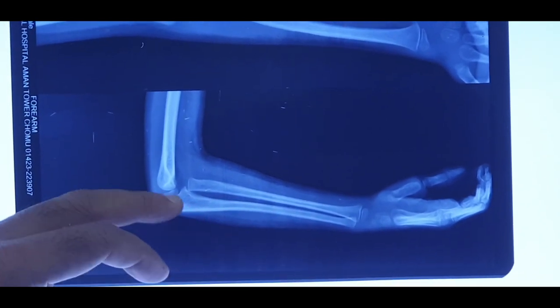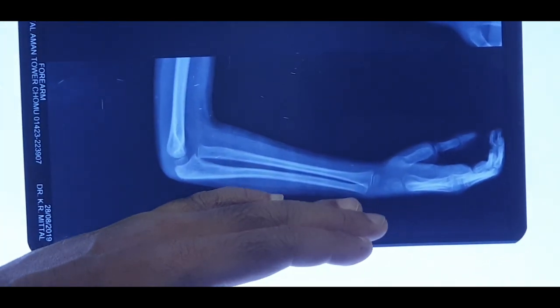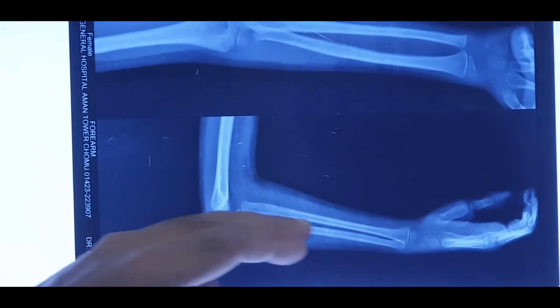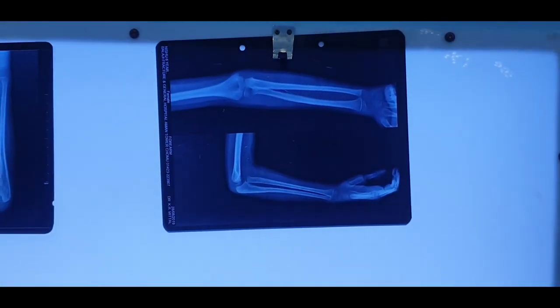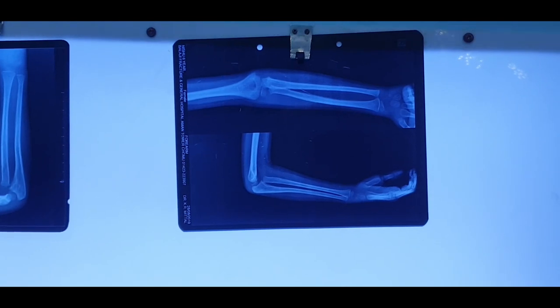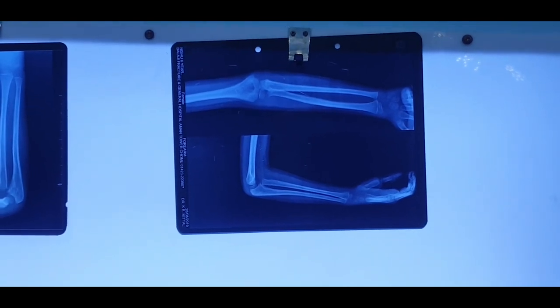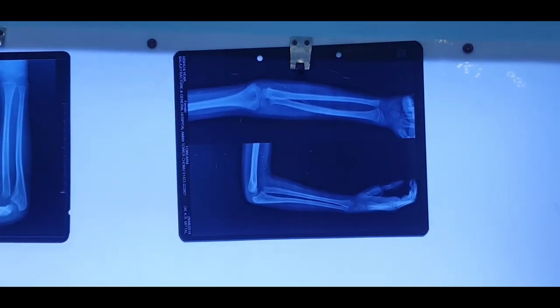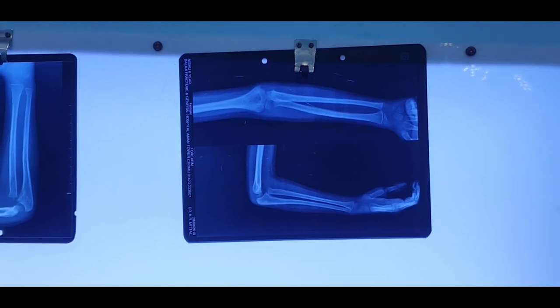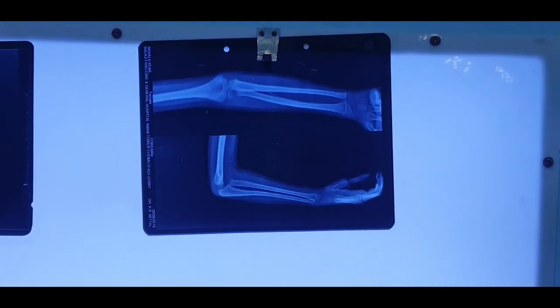The ulna should be straight, but now it is bowed. Due to this, the length of the ulna has become short, which happens when there is a fracture of the ulna. In this case, there is no fracture. However, because of the bowing, the ulna has become short and the radial head has dislocated.